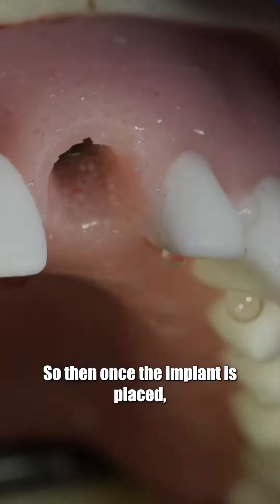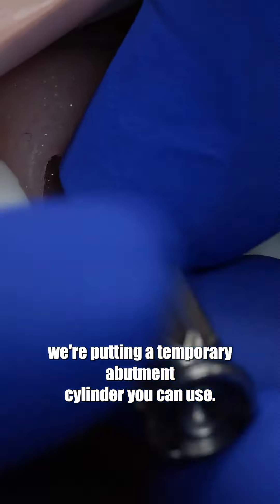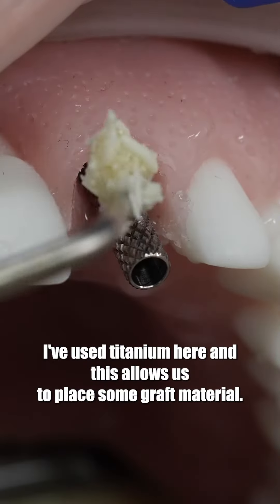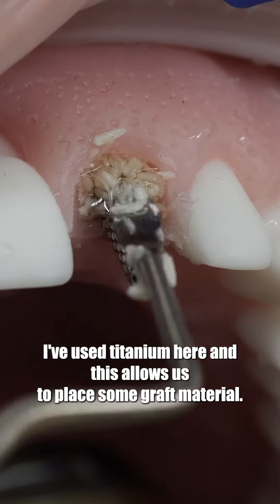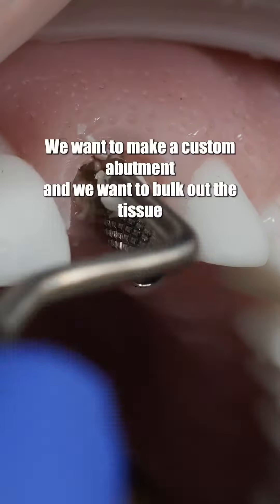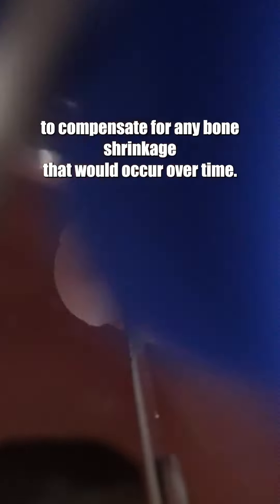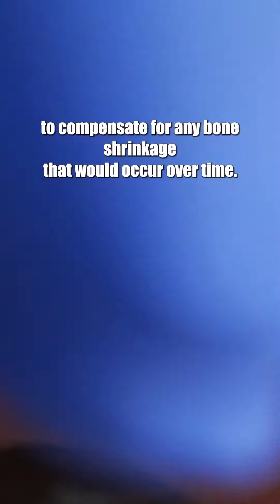Once the implant is placed, we're putting in a temporary abutment cylinder — you can use PEEK, I've used titanium here — and this allows us to place some graft material. We want to make a custom abutment and bulk out the tissue to compensate for any bone shrinkage that would occur over time.